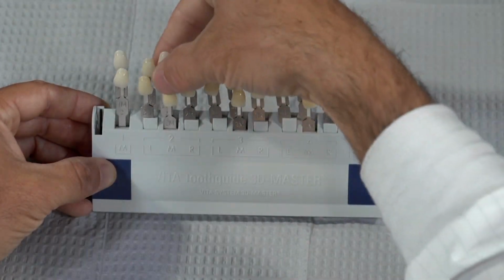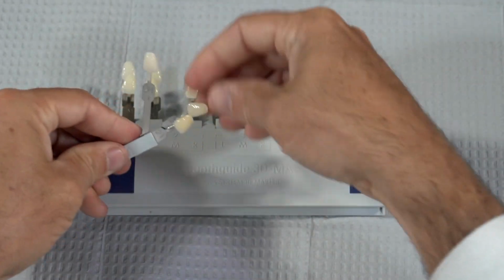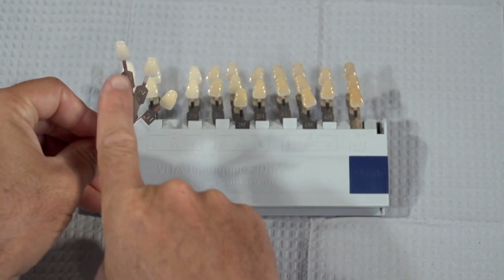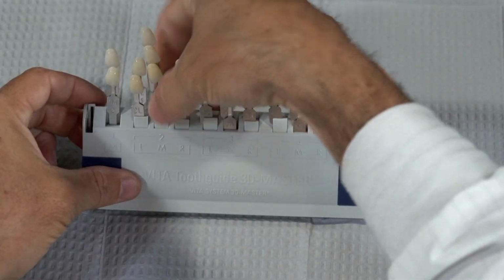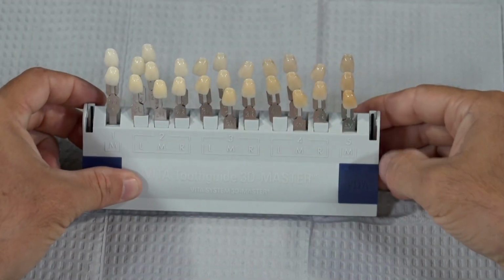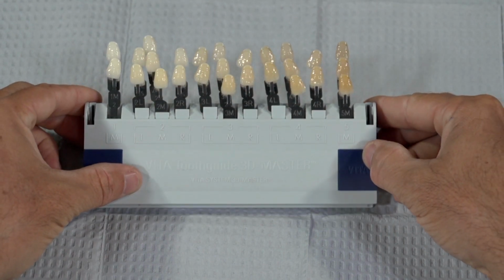Shade guides are now being designed to make them easier to work with. The Vita 3D Master Shade System allows the value of a hue to be selected by first grouping colors and then choosing the value in each specific color group, sort of like a drop-down menu. I like to call this method tabbed browsing.